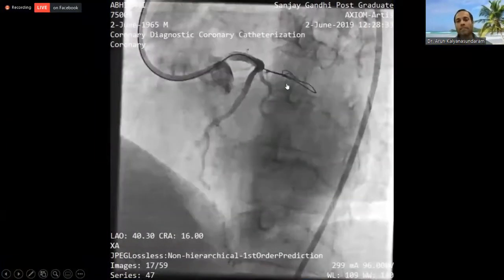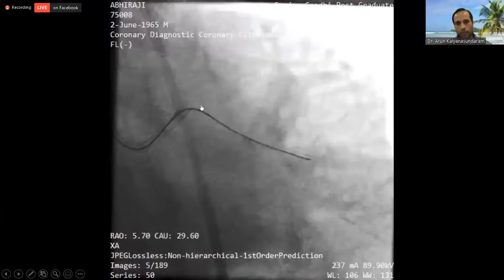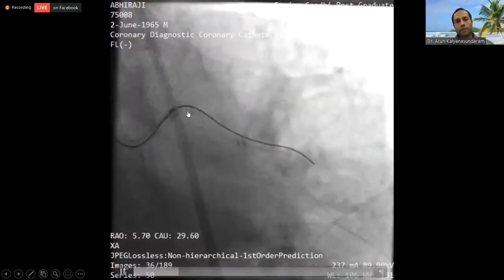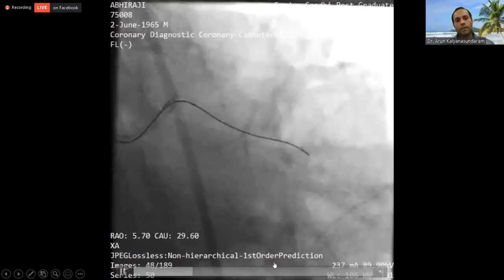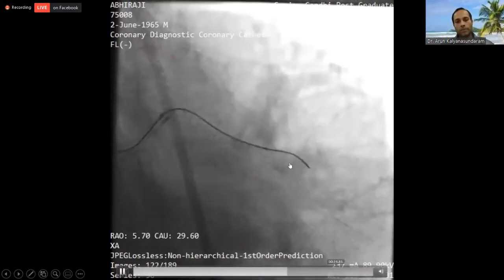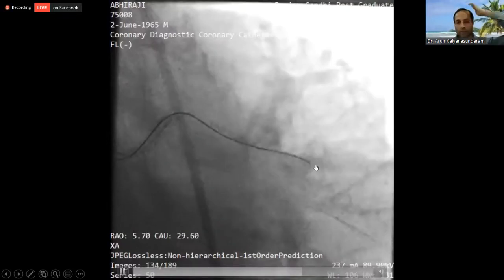Now you're in the vessel architecture. Once you've done that, get the microcatheter down, put in a stiff wire. The two dots that you see there, that's the Stingray balloon coming down. And then again, in the interest of time, I'm just going to go. There it is. Boom. You're there.